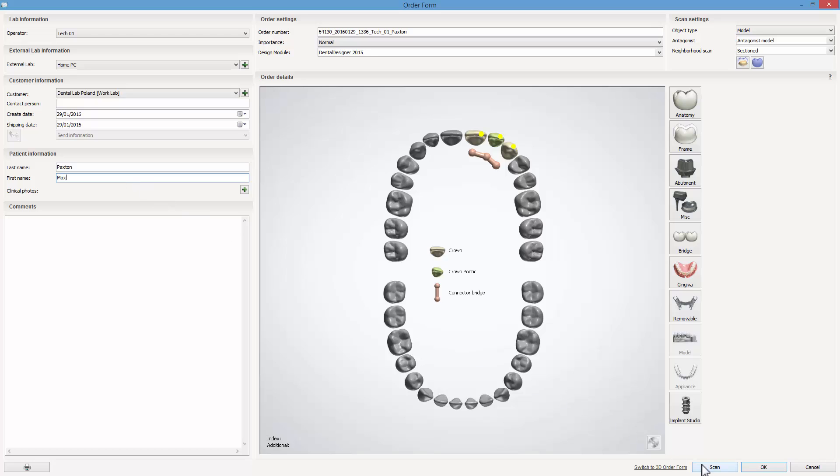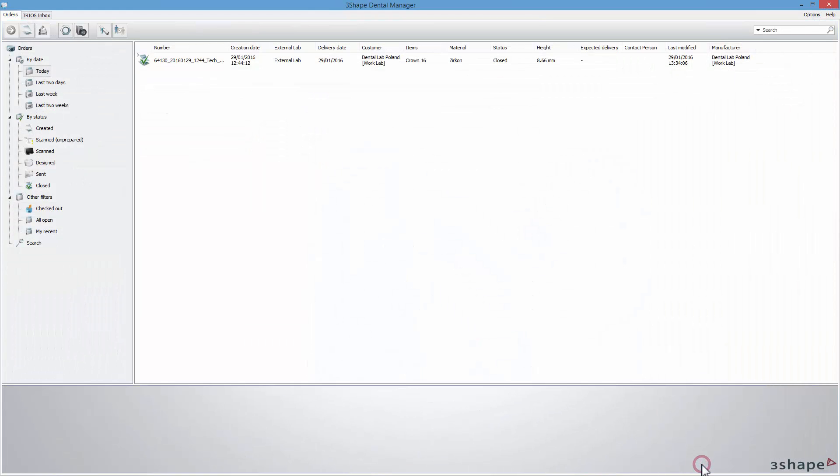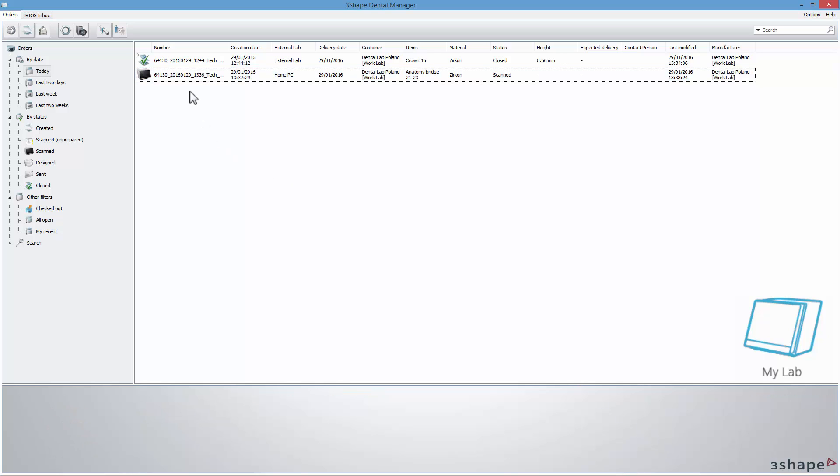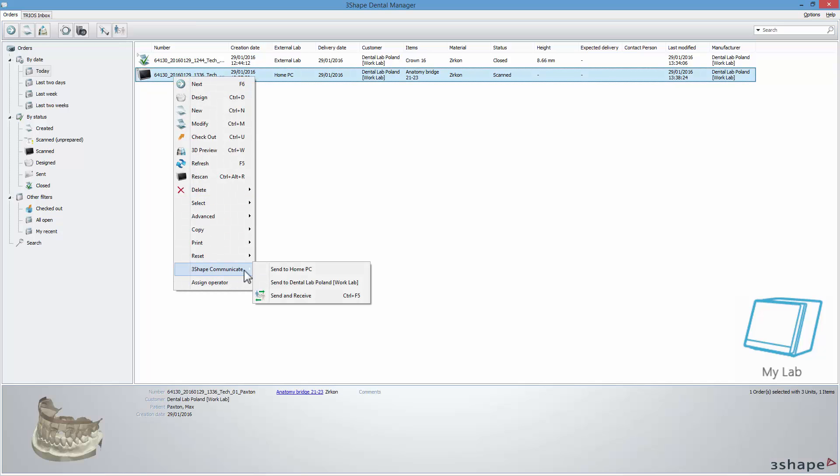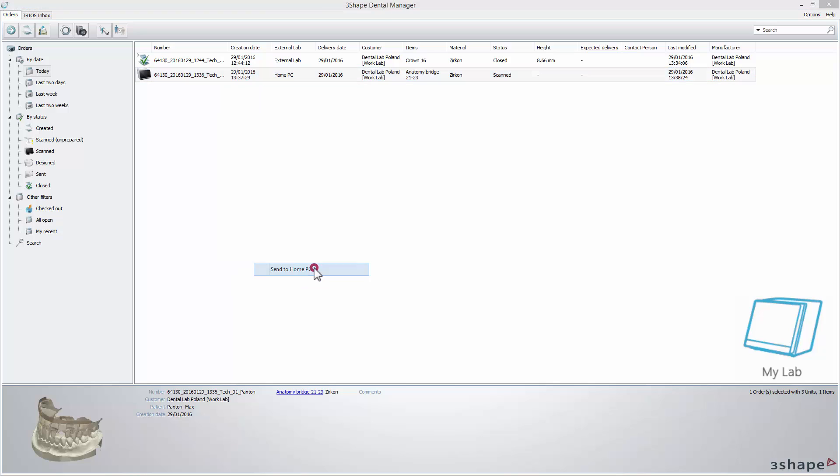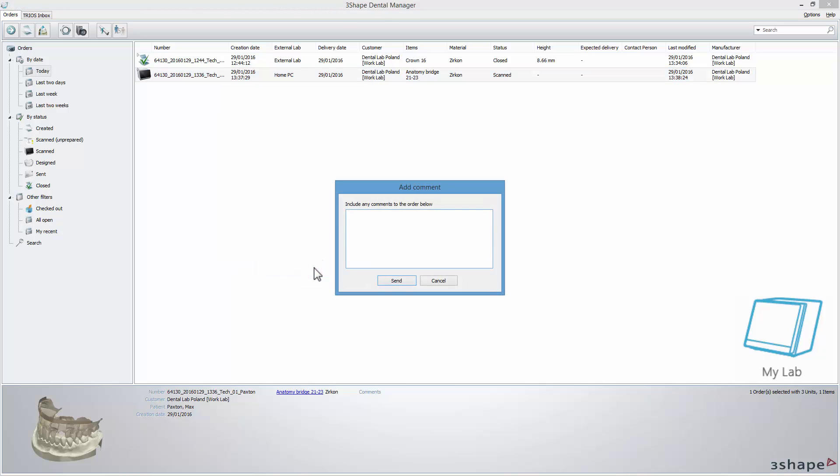Scan models and start the design or send the order straight away. To do so, right-click the order, choose 3Shape Communicate and send the order to home PC or other workplace.